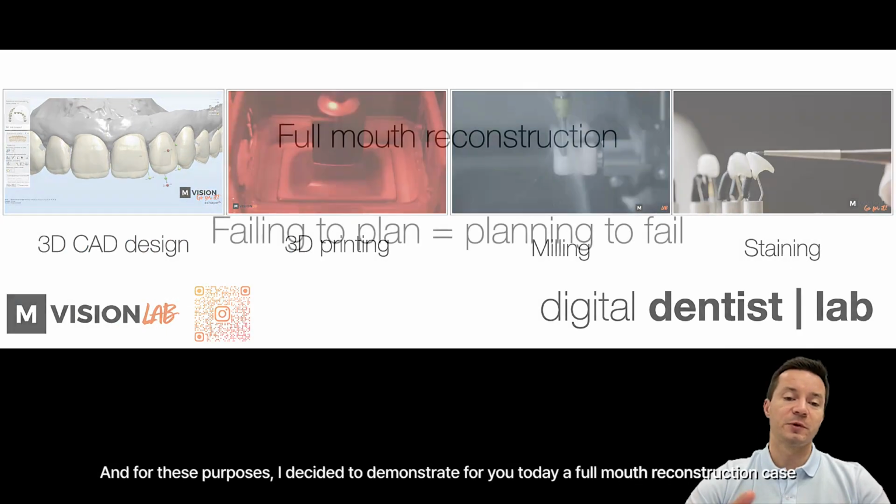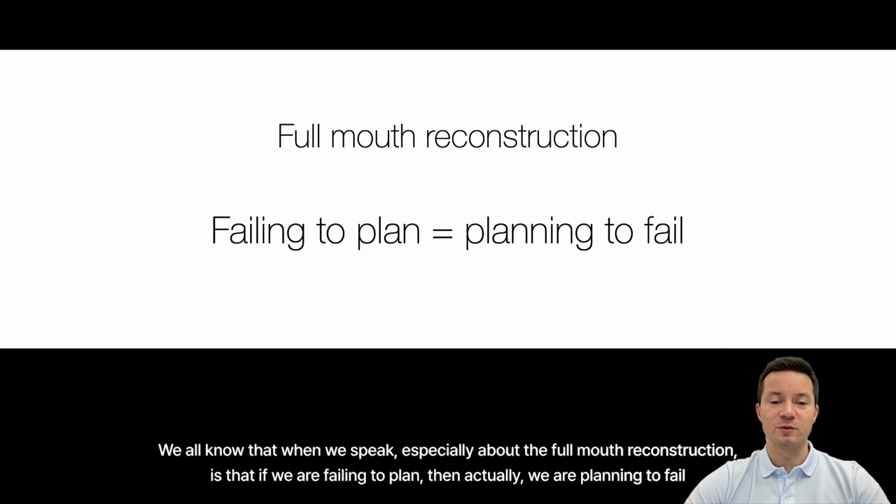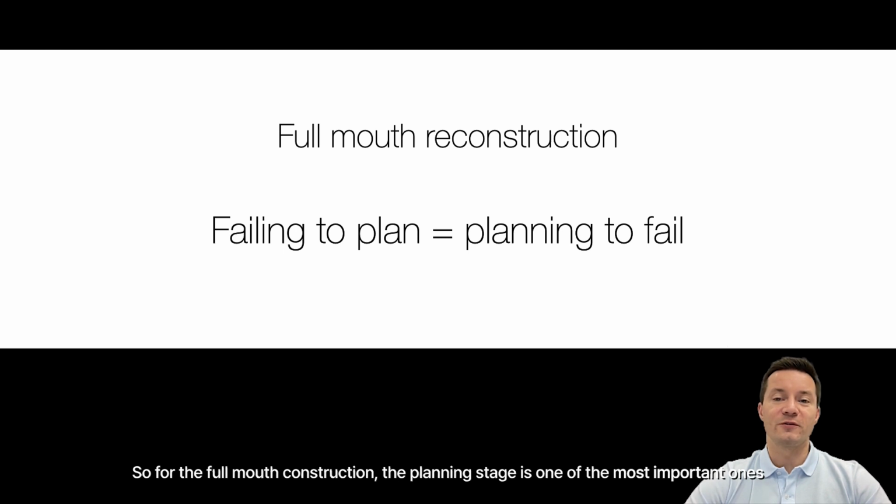And for these purposes, I decided to demonstrate for you today a full mouth reconstruction case. We all know that when we speak about full mouth reconstruction, if we are failing to plan, then actually we are planning to fail. So for the full mouth reconstruction, the planning stage is one of the most important ones.